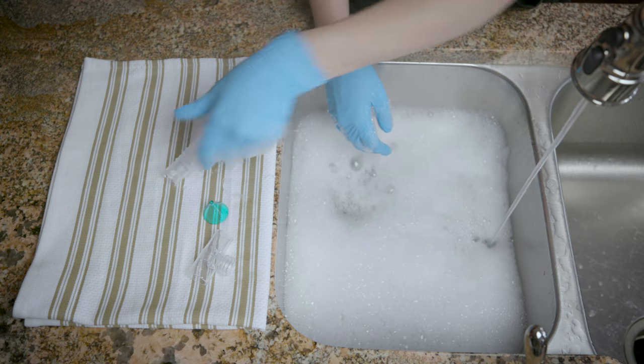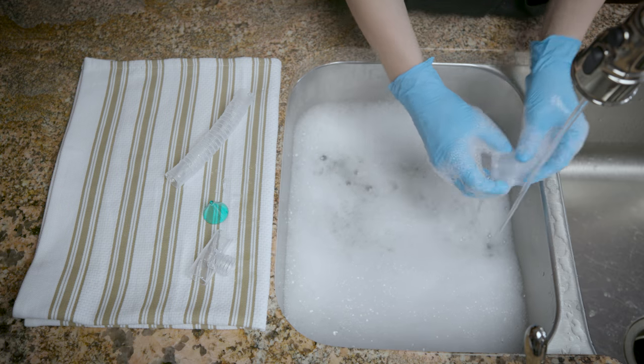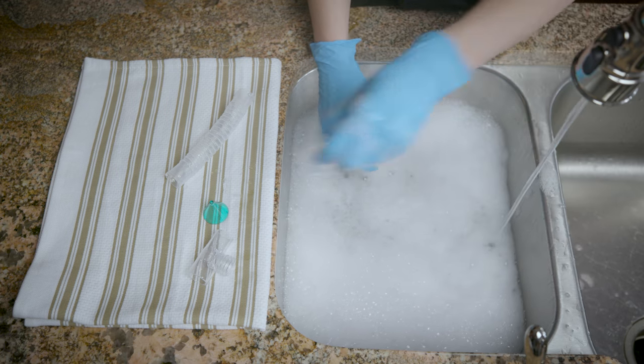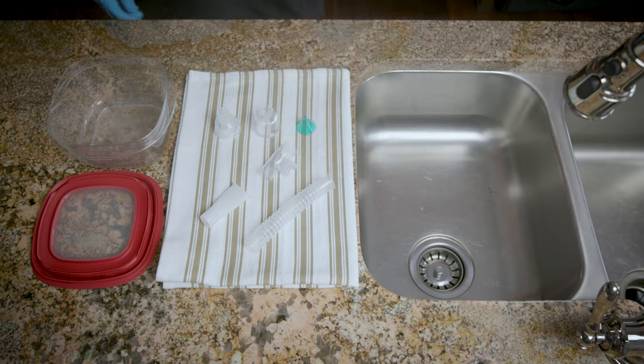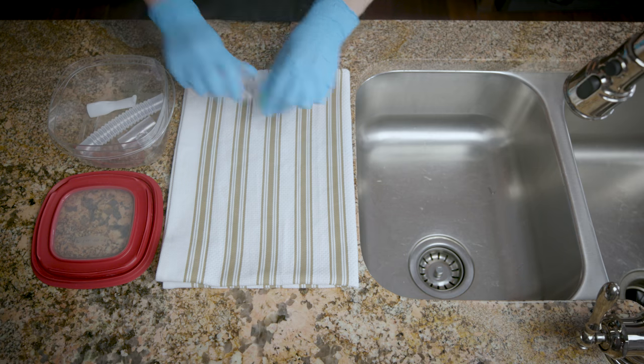Follow the patient's care plan when cleaning neb supplies. A common recommendation is to wash the neb cup and delivery device after every treatment. Use warm, soapy water and rinse thoroughly. Allow the supplies to air dry before storing them in a clean, dry container.